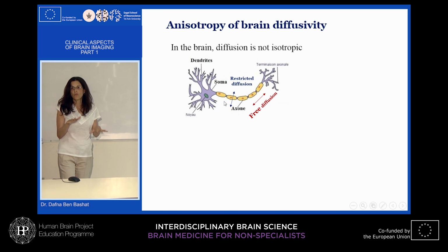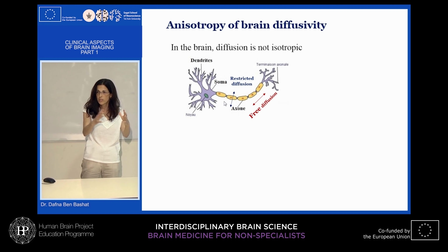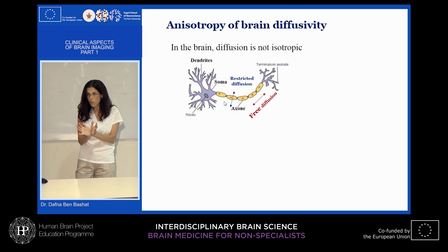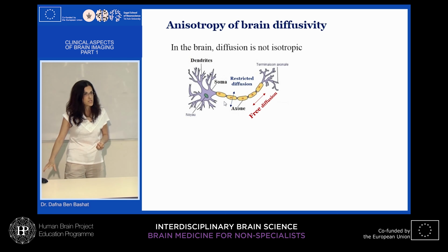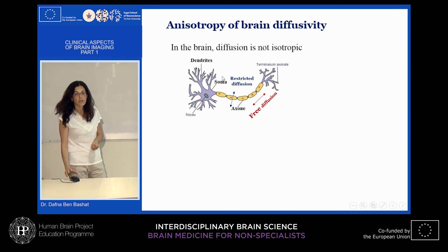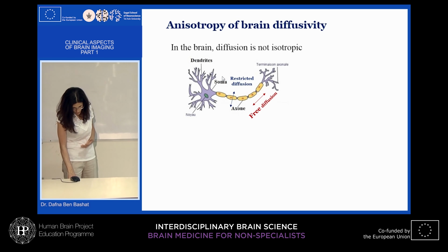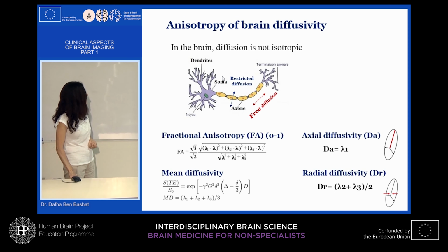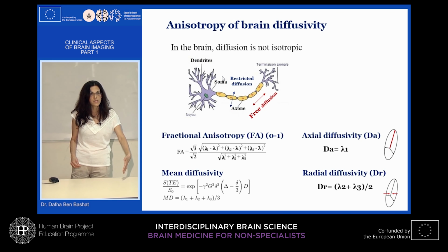And the ratio, or the difference, the anisotropy of the diffusion: isotropy means it's like a ball, in all directions it has the same magnitude, or in this case, very anisotropic. This is another very important parameter. And this is the theory on which all the diffusion tensor imaging methods have been built, meaning we acquire with at least 6 directions.